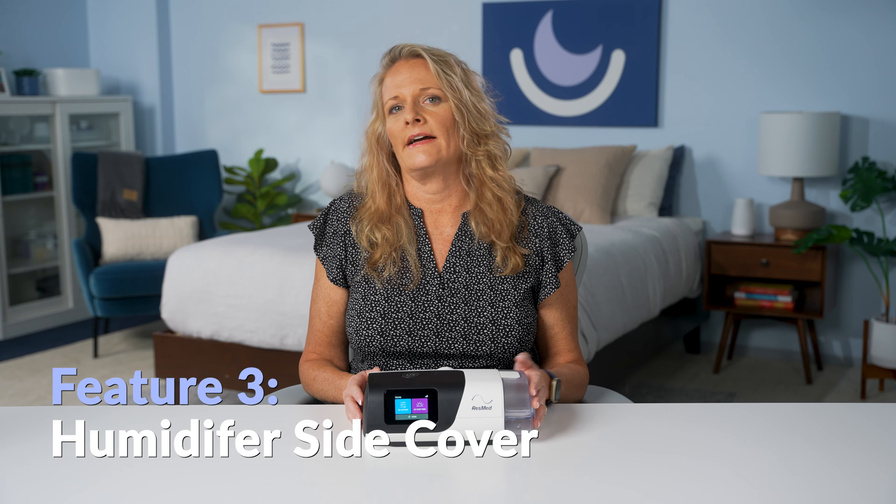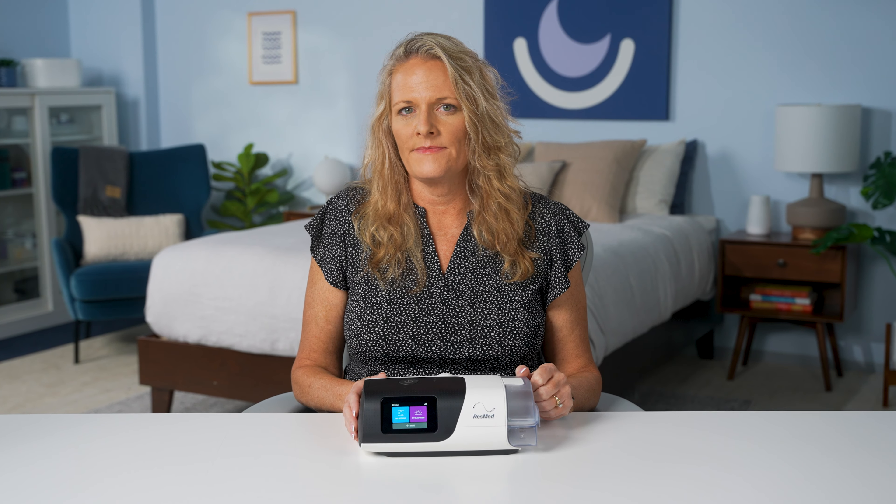If you just started CPAP therapy with the ResMed AirSense 11, congratulations. You have one of the best CPAP machines on the market. Today, I'm going to show you some of the cool features and pro tips you might not have known before. Hi everyone, I'm Diane, respiratory therapist here at Sleep Doctor.